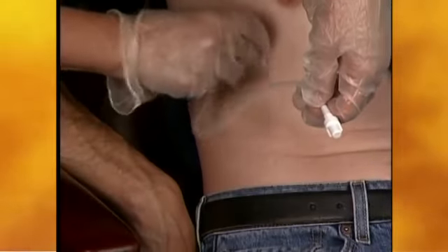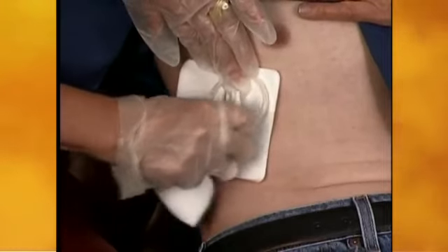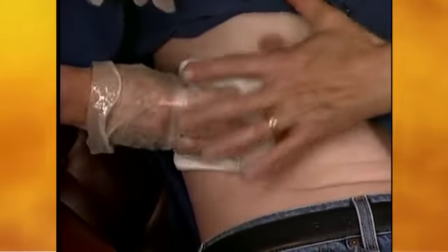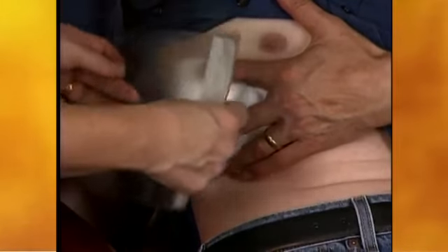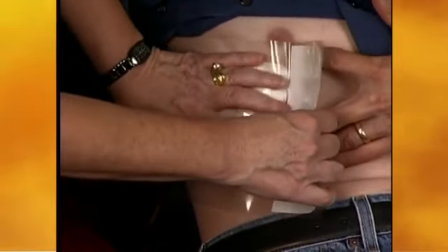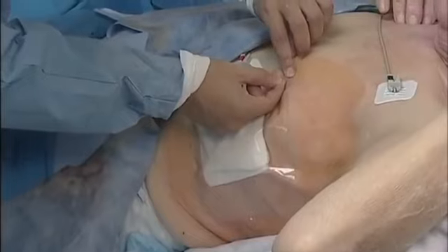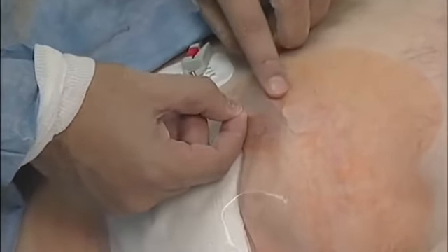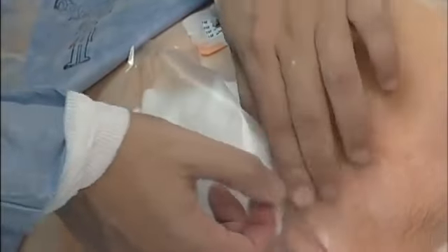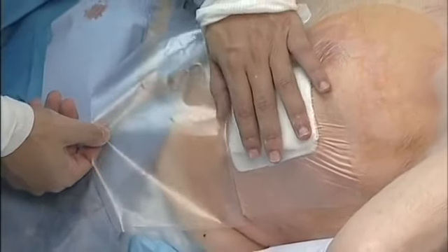Clean the skin around the catheter with the last alcohol pad. Place the foam pad around the catheter, wind the catheter in loops, and hold it on top of the foam pad. Then place the gauze pads over the catheter. It may be necessary to remove the gloves before applying the adhesive dressing. Peel the larger of the two pieces of paper from the back of the adhesive dressing, center the dressing over the gauze pads, and press it down. There is a plastic covering over the adhesive dressing. Start at one of the corners where the paper backing is still in place, bend the covering back, and pinch the paper and the dressing to separate them from the cover. Peel off the plastic covering, remove the remaining paper, and press the dressing down.